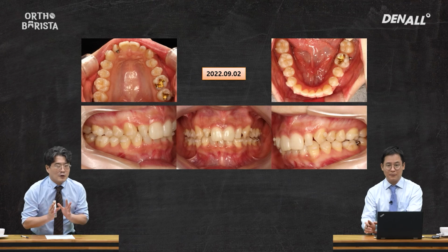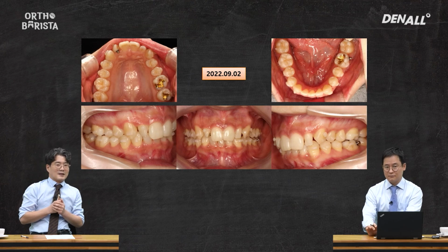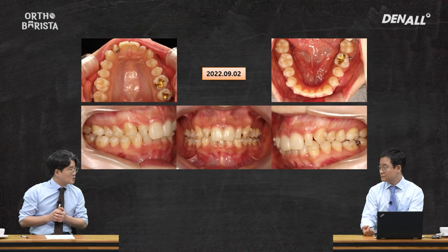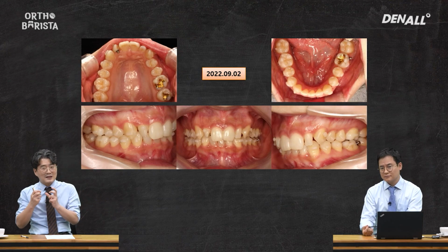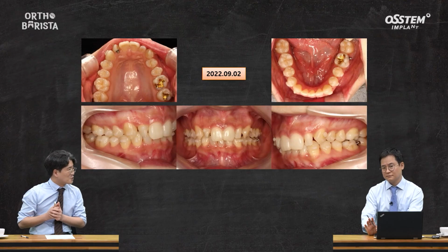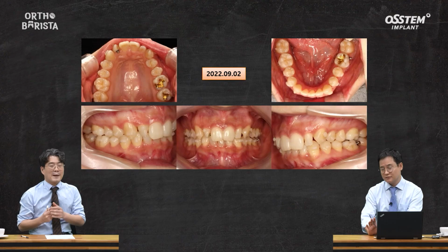Actually, I can talk a lot about this case. For molars, if we are to induce distalization, there will be some side effects. More details may be covered by Dr. Lee later. Anyway, in this case, those side effects were rather taken advantage of. Right, that can be one way of seeing this case.